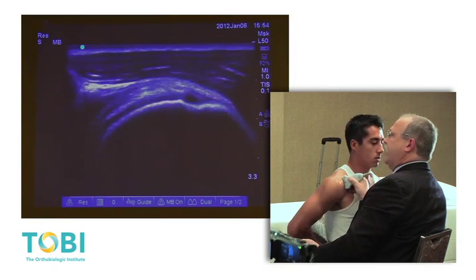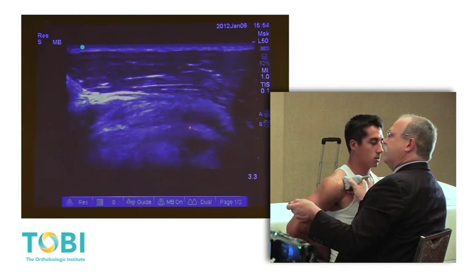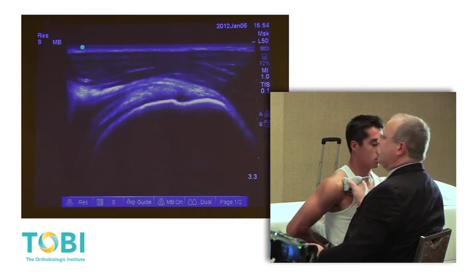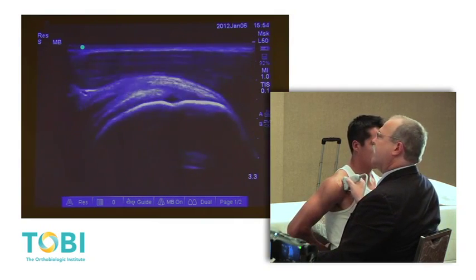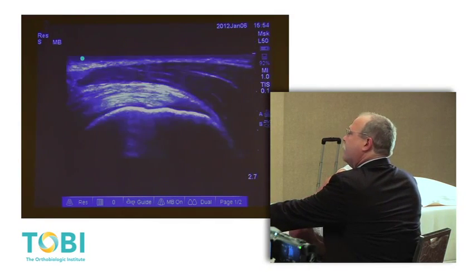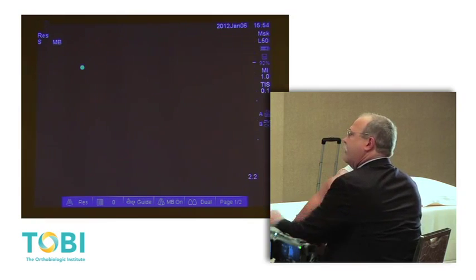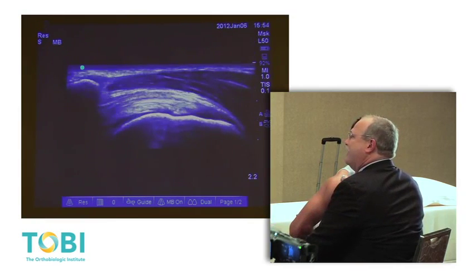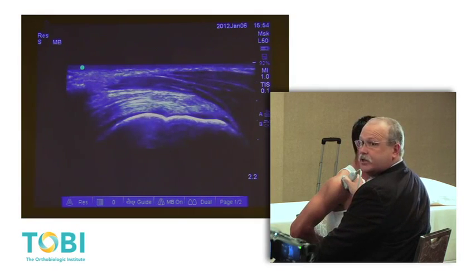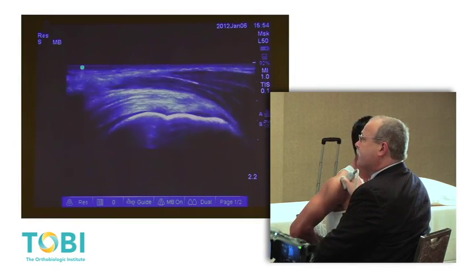I always like to scan medially until I find the biceps tendon. Now I know I've seen the most anterior portion of the supraspinatus. Then it becomes just a matter of sliding and rolling the transducer around the shoulder. Better practice what I preach, keep my target in the center third of the image, right? Notice when I do that, did you notice the resolution improvement by placing that in the center third of the image? Notice how those fibers light up a lot better now?